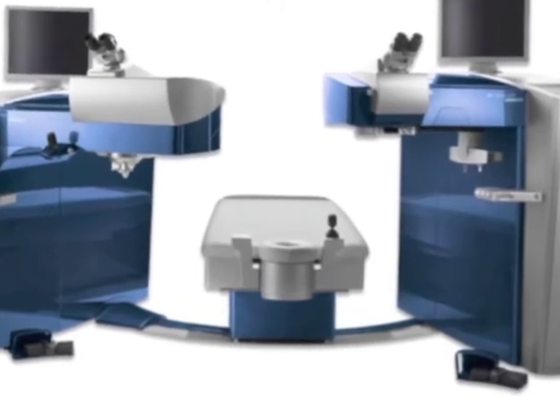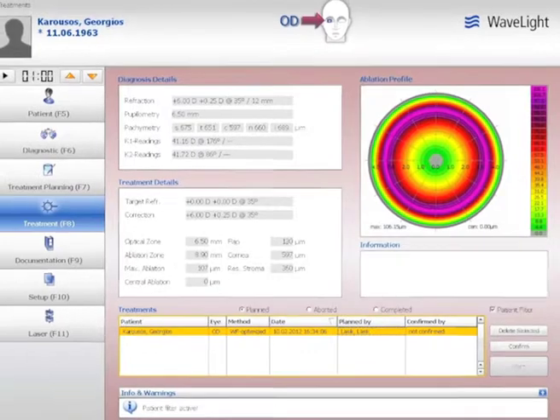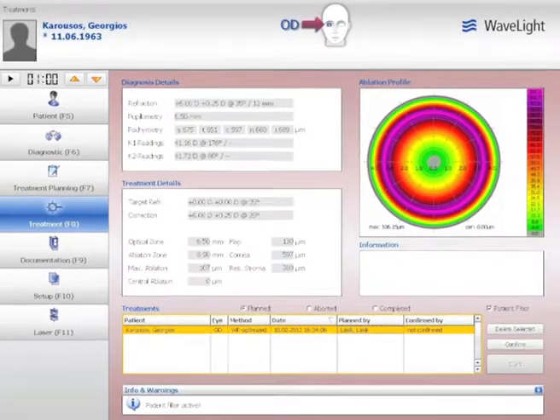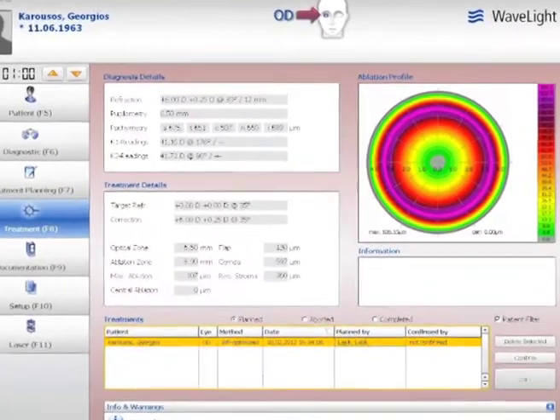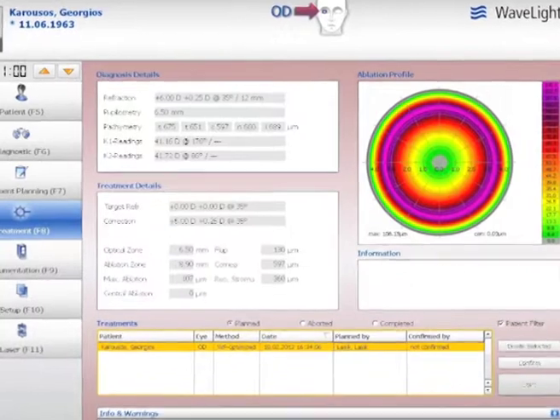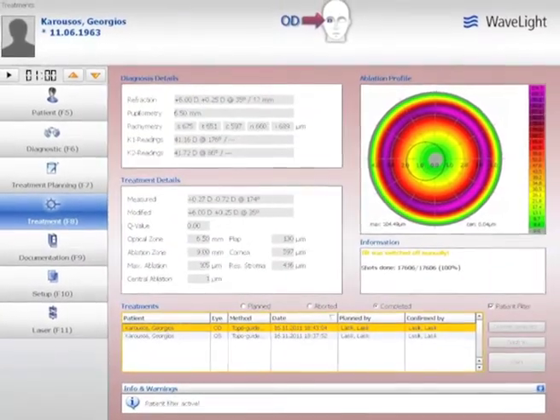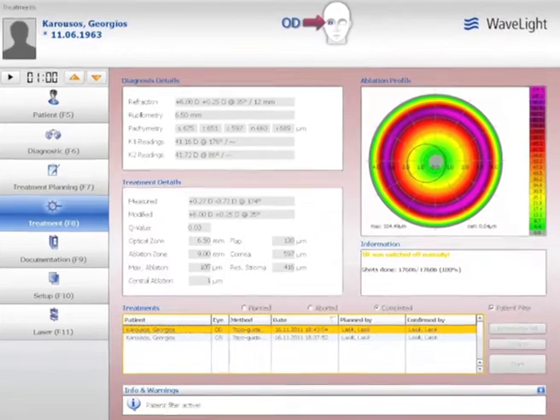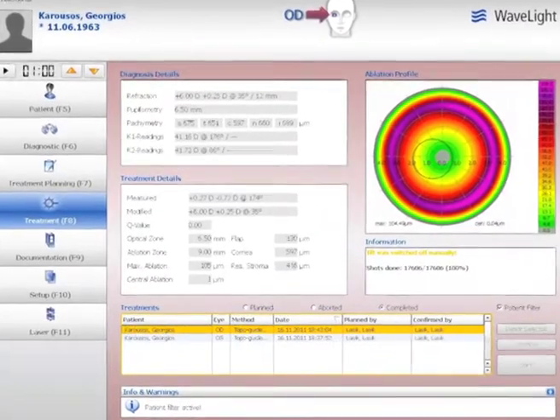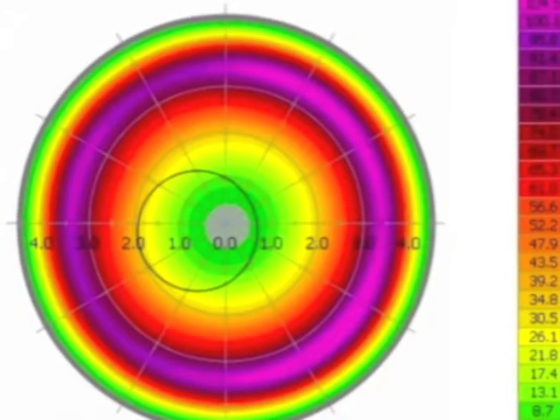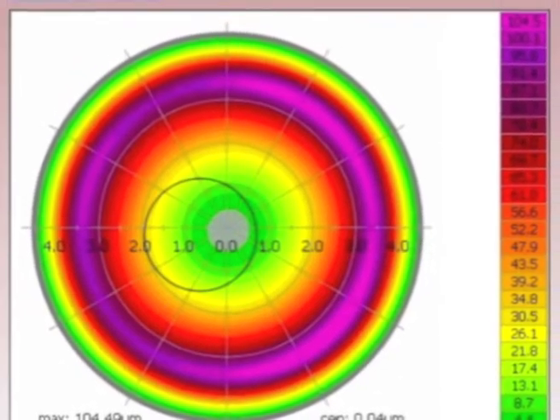We're using the Refractive Suite: the FS200 femto on the left and the EX500 on the right. Here is a standard hyperopic correction treatment plan. You can see how the pupillary aperture as captured by the topographer would be centered, but with topography-guided treatment you can clearly see the de-centered place of the ablation — centered on the visual axis of the patient.